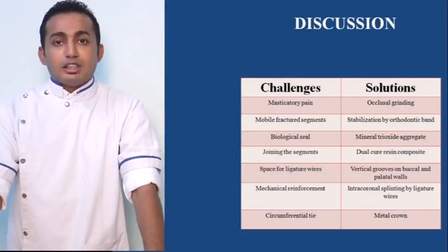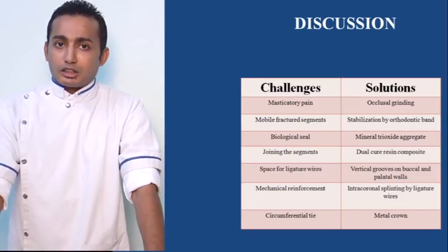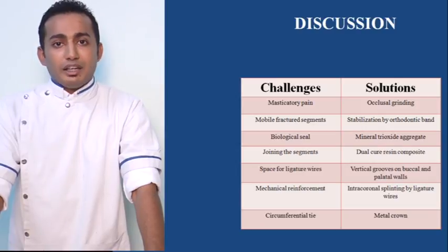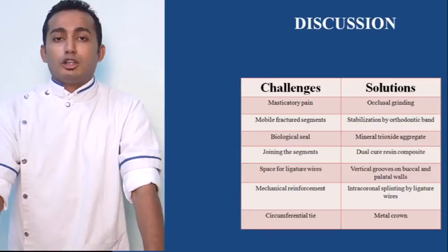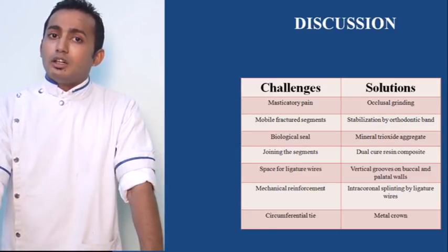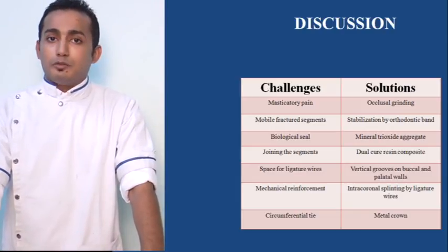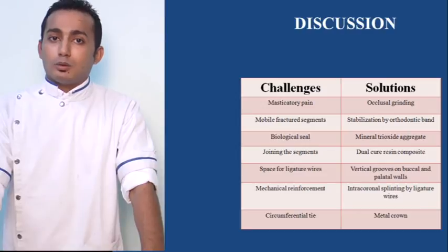Vertical split fractures seen in the maxillary molars is a rare finding. Also, this kind of fractures are seen associated with endodontically treated teeth. But in my case, it involved vital maxillary molars, making it all the more a unique case. The previously used methods did not take into consideration the biological aspects of the fractured tooth. But we, in our case, aimed at providing mechanical strength to the tooth and making the tooth biologically sound.